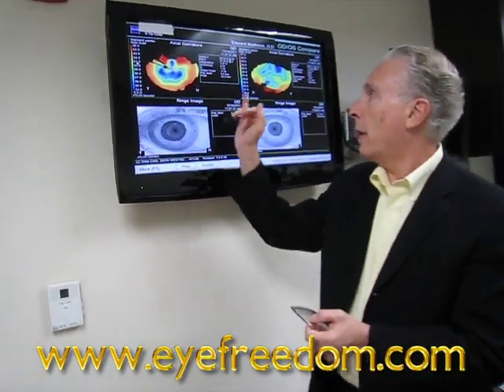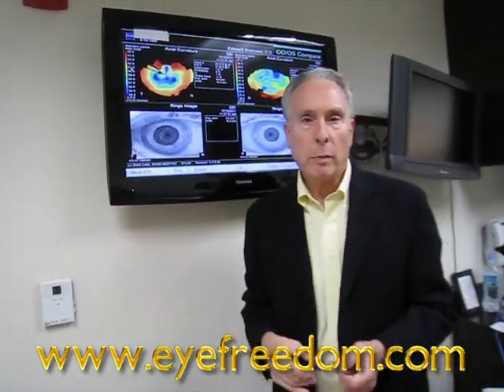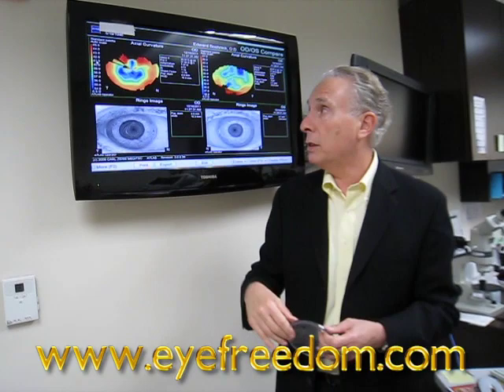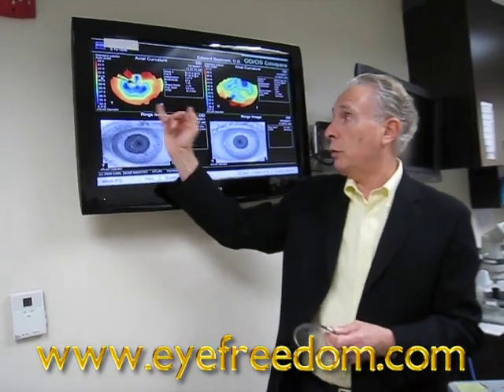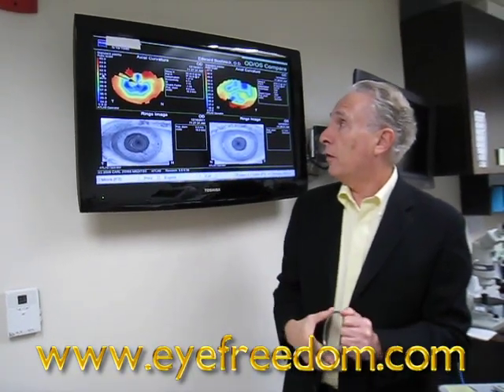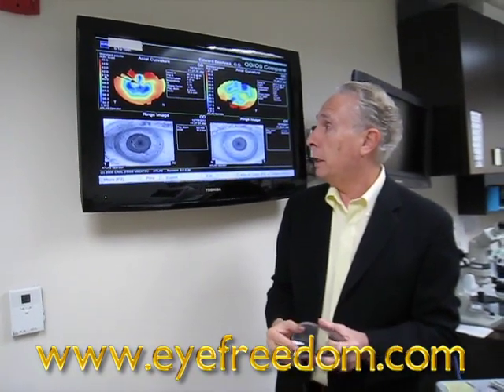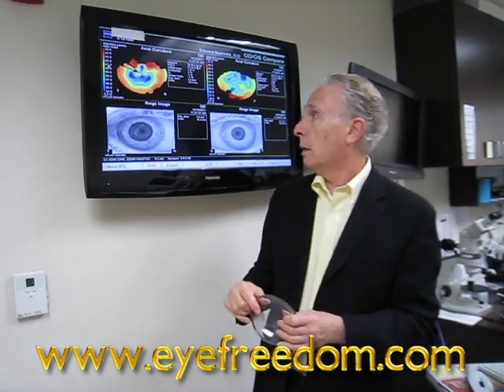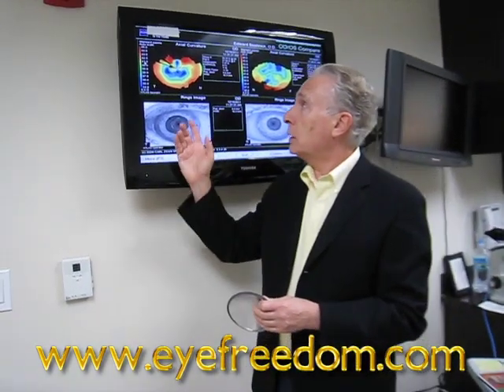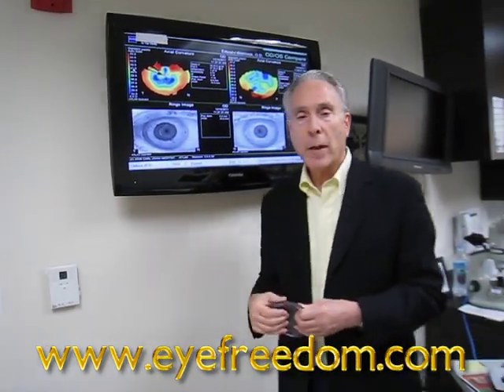This particular patient is wearing gas permeable scleral lenses and she has 20/20 vision now for the first time in maybe 20 years — and that's basically it on this particular patient.